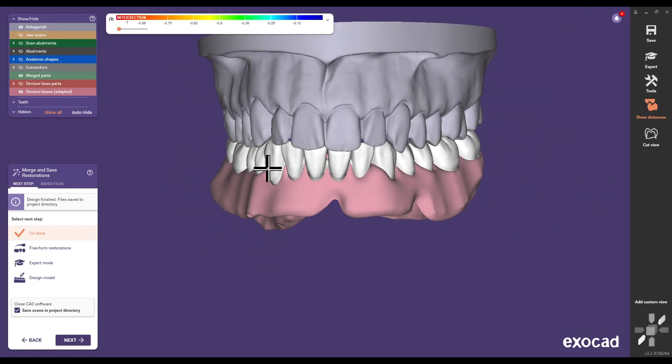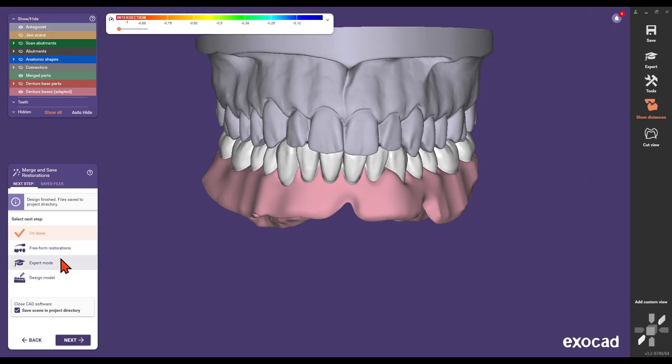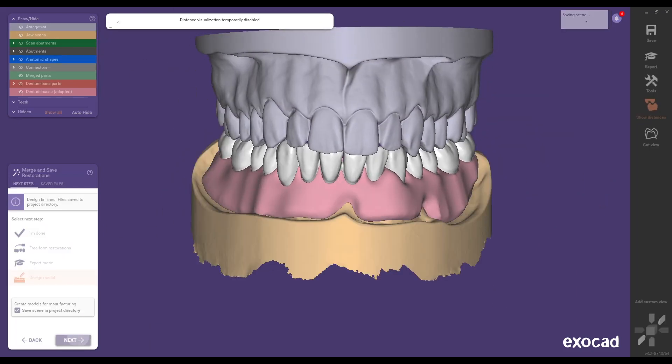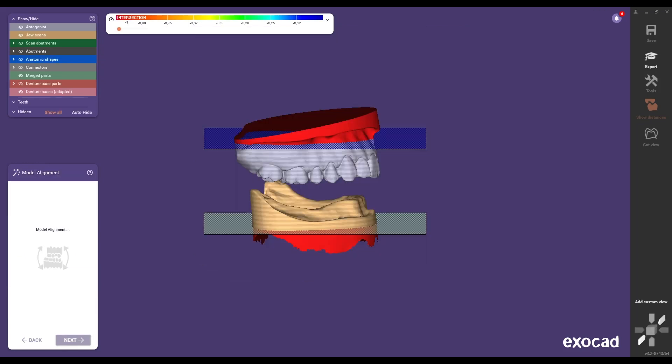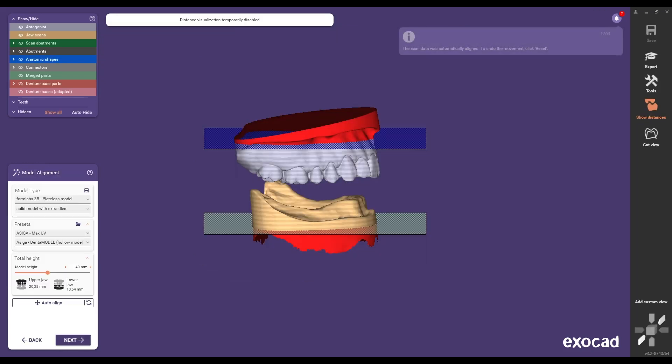Close the CAD software and proceed to manufacture the restoration or go to the design model step to create a printed model with the NovaLock laboratory implants CAD CAM.